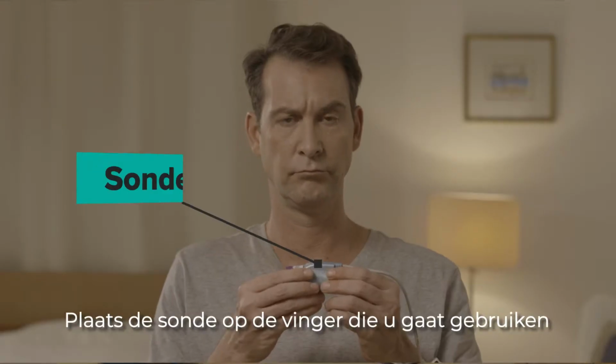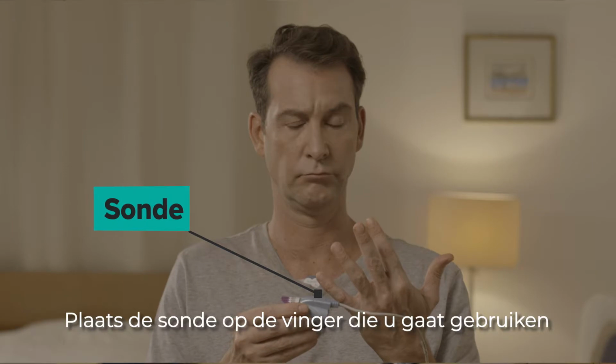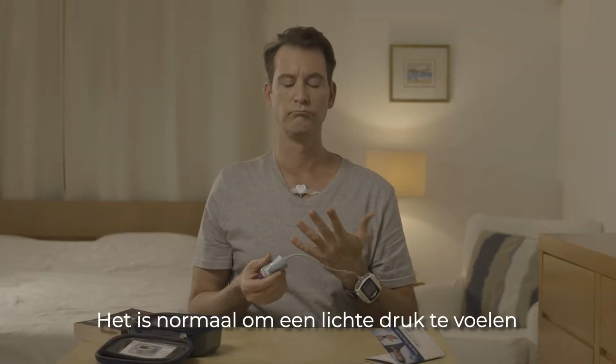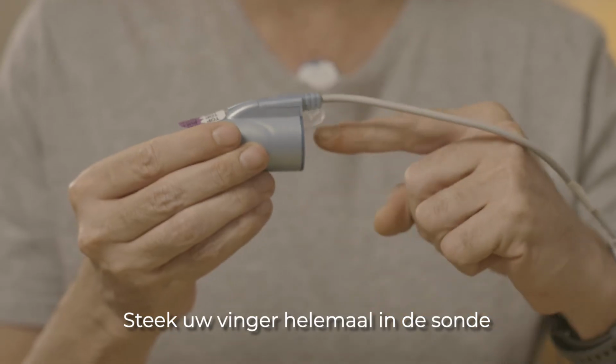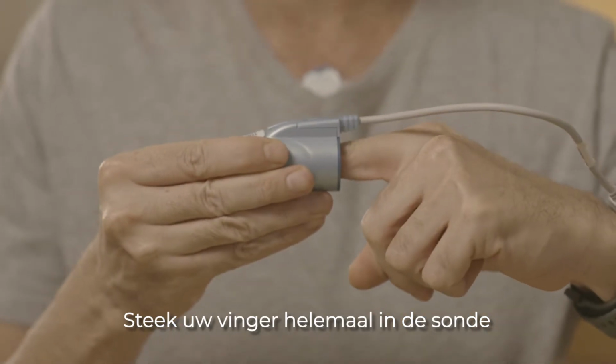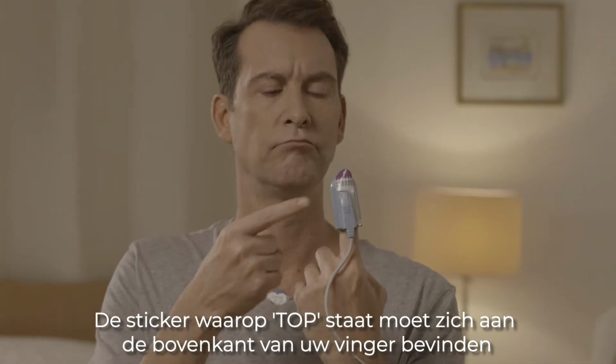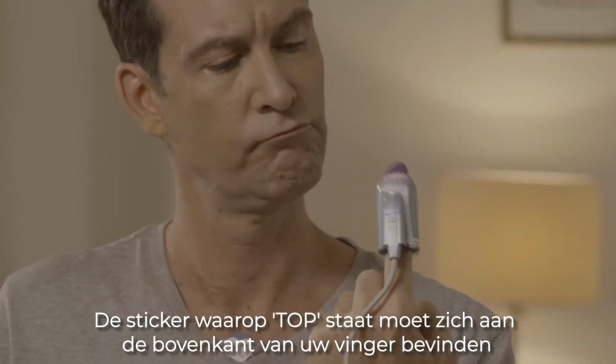Place the probe on the finger that you have been told to use, preferably the index or ring finger. It is normal to feel a little bit of pressure. Insert your finger all the way into the probe. The tab labeled top should be situated on the top side of your finger.